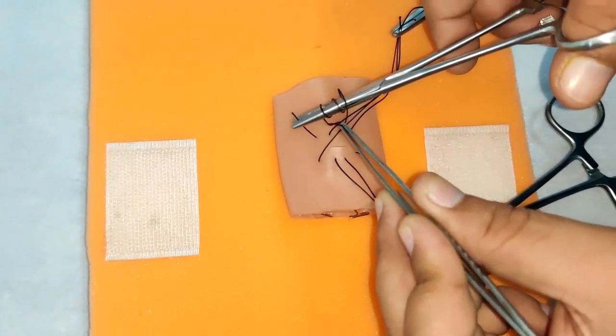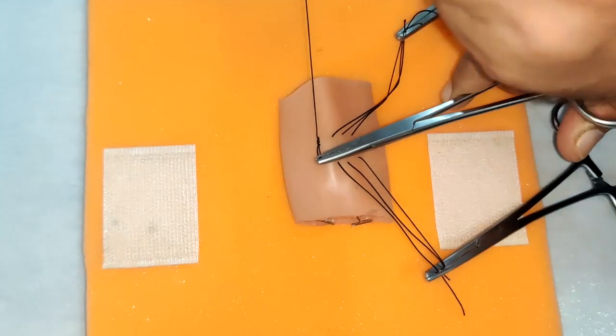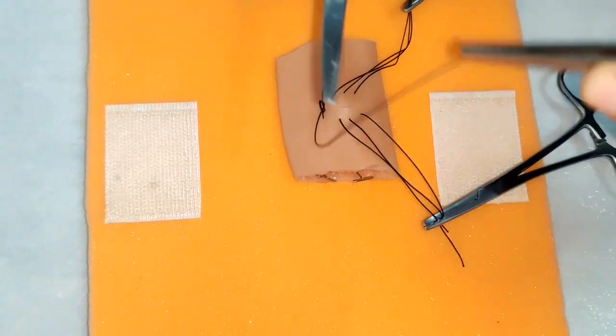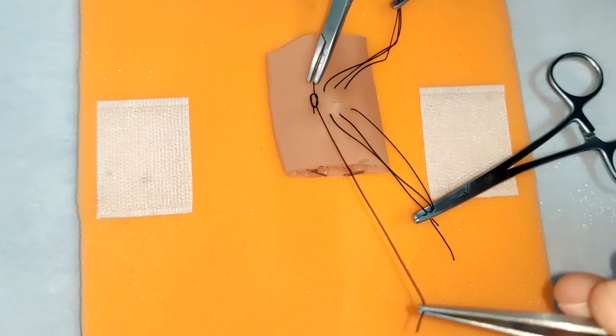We will start by suturing the edges and secure them. We will do a primary instrument tie. Once we are done with the suture, we will cut it.